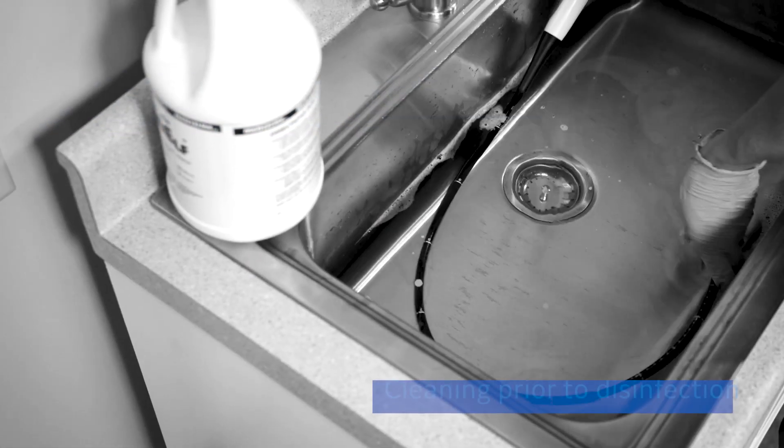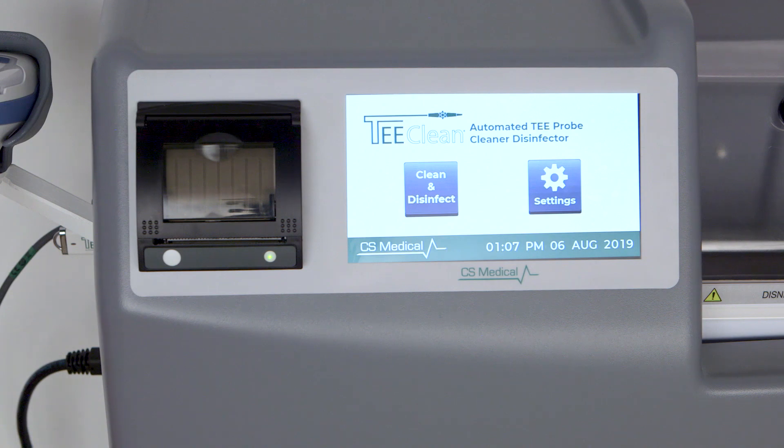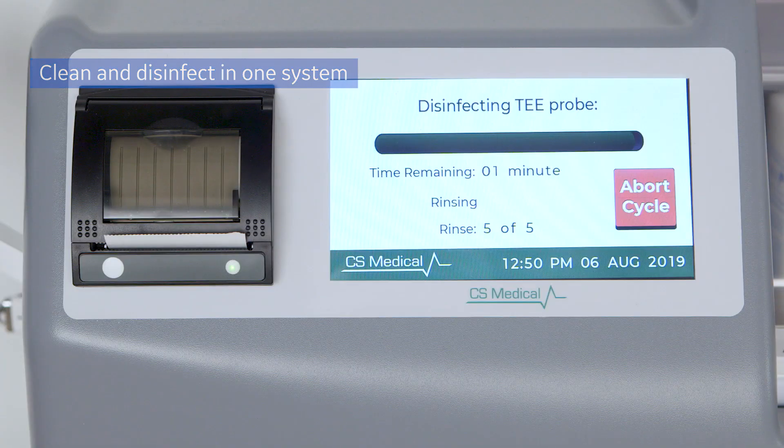Complete and thorough cleaning, usually a separate manual step, is vital to achieve high-level disinfection. With the T-Clean system, this process is incorporated into the system, so both cleaning and disinfecting are performed in the same automated system.